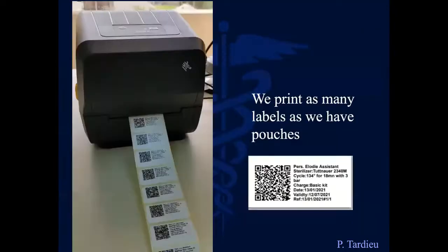So the next step is to print. You print, you save, and you print all that. So you have all these labels which are printed. And the good thing, which is important, and this is different from any other software in the world: the reference is showing the date, you remember, #1 and /1. This is the number 1 pouch. The /2 will be the number 2 pouch. /3 will be the number 3 pouch. So you identify all pouches separately.